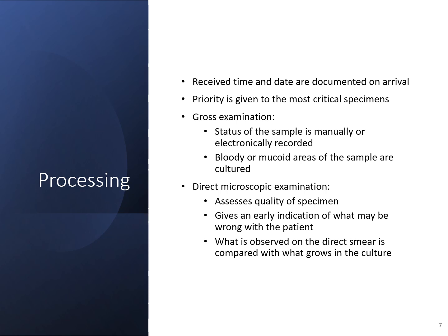You're able to assess the quality of the specimen. So with sputum cultures, you're looking for a quantitation of white blood cells and epithelial cells to see if it's possibly contaminated. It also will give an early indication of what can be going on with the patient.